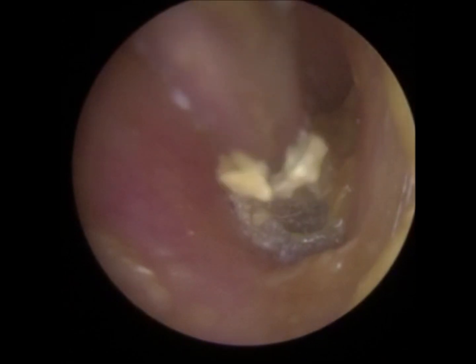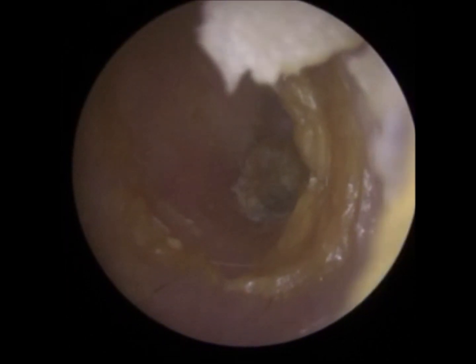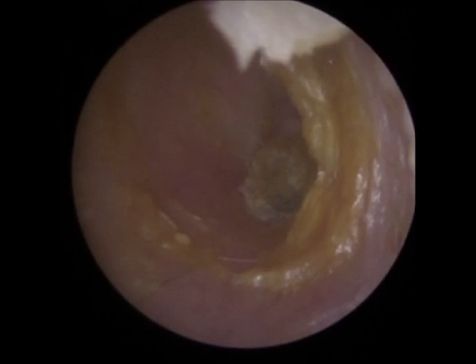It's soft and gooey so it's not going in very well — it's too soft. What it does is it just clogs the tube. I might just put some olive oil in to suck it in, and then I'll go back in and remove it.